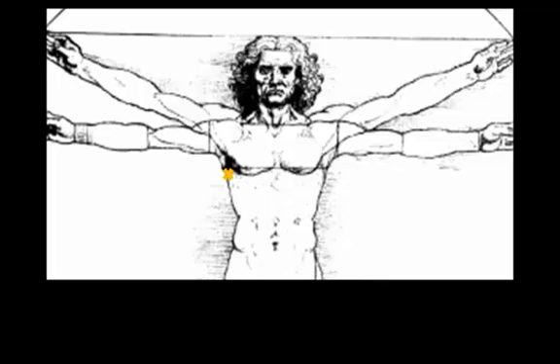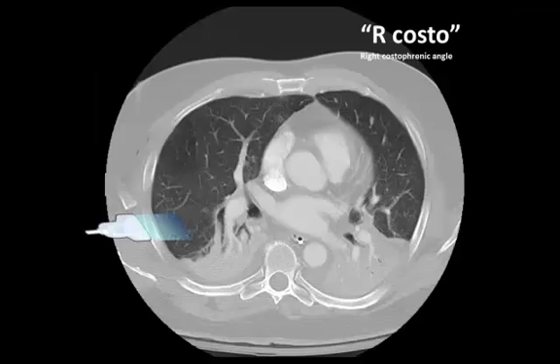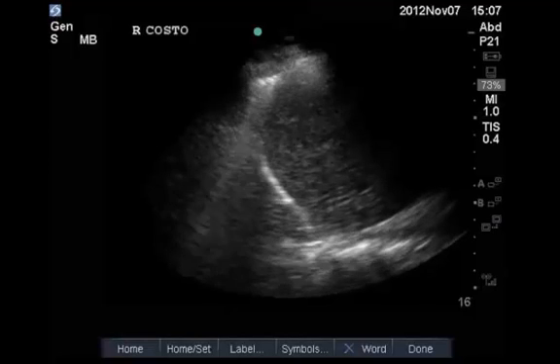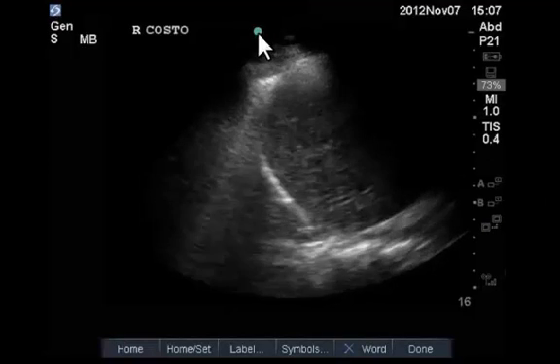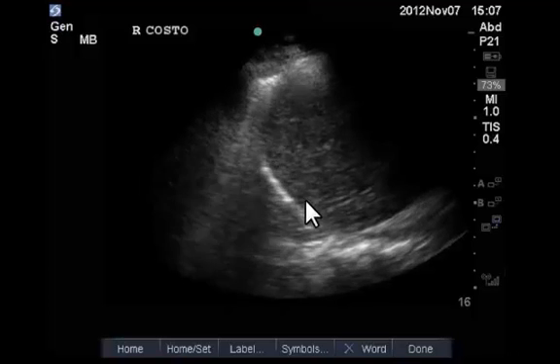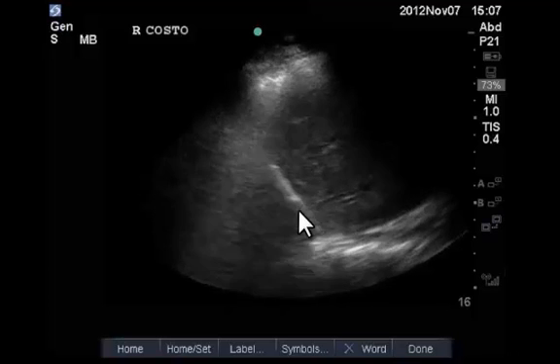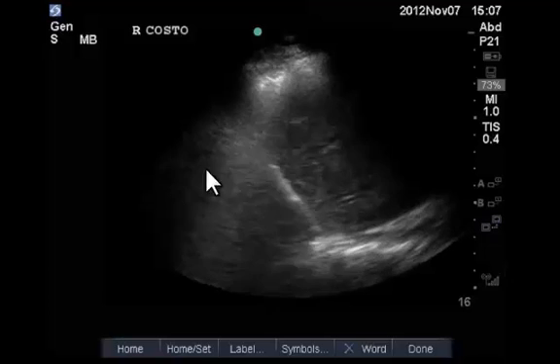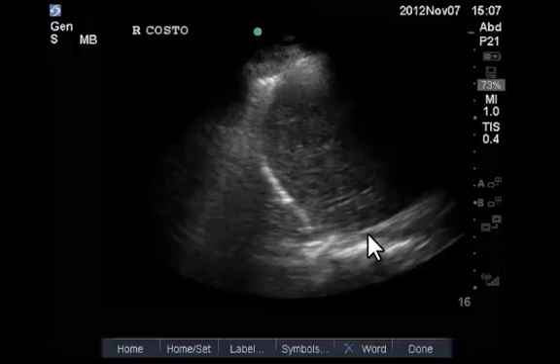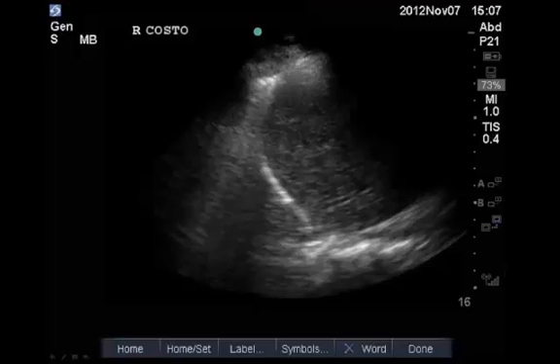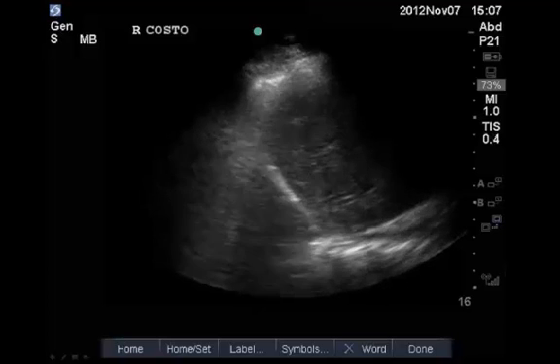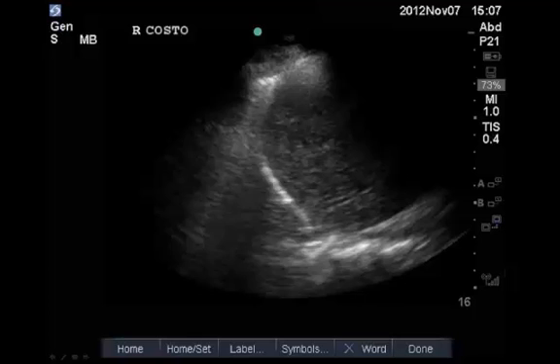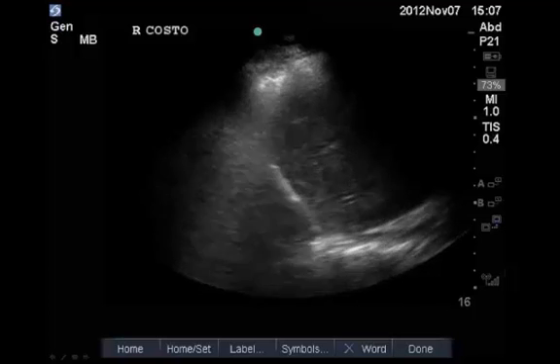Moving on to the pleural assessment, we would then look for the costophrenic angle — the right costophrenic angle view. Here we find an abdominal preset with the dot on the left side, and the liver on the right side with the diaphragm. We can see a curtaining lung coming in from towards the patient's head, suggesting the absence of pleural fluid in this instance. The probe for this view is placed in the mid-axillary line, just inferior to where you were previously for the lung assessment.